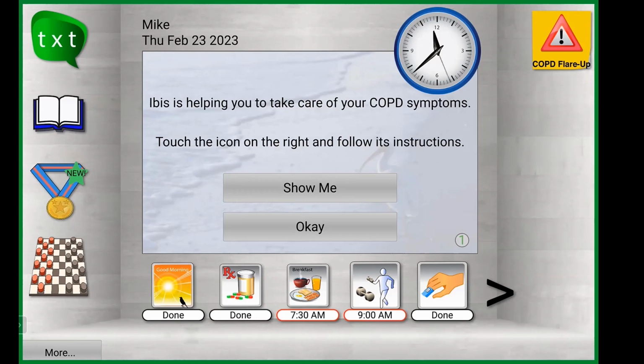So I just want you to leave with the lasting message that all of this data, self-reported by yourself, is connected to licensed medical professionals who are here to help you in that immediate moment, to work with you, to resolve the issue, and to coordinate the data with the people that care for you. And that can be family, that can be doctors, specialists, like I mentioned. And that's how we make the whole ecosystem work. Keep everyone informed. Most importantly, keep yourself comfortable in the home and let all the medical professionals support you to give you the best care possible. But it all starts with knowing how you're doing.